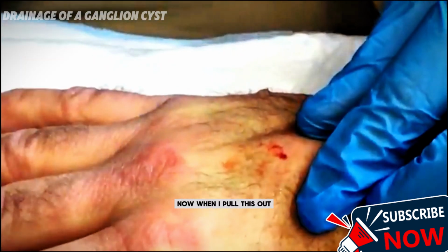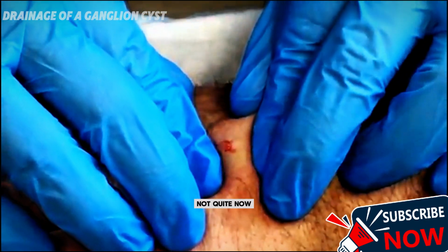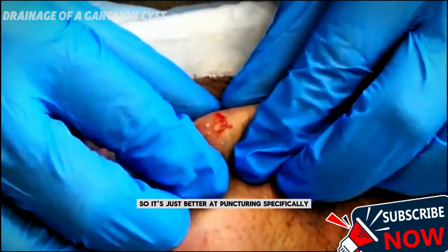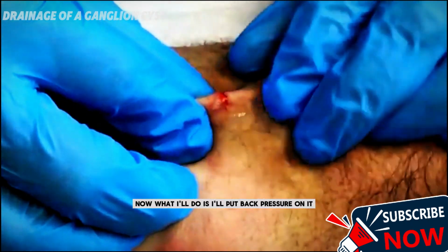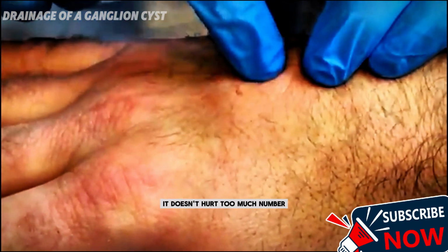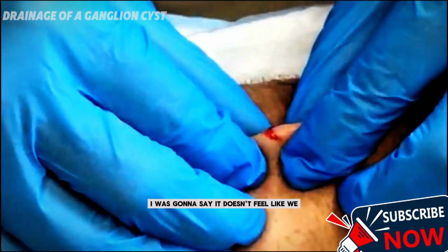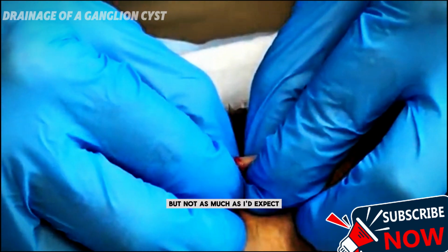Now when I pull this out, you might see a little bit of material coming out. Not quite now. I like to use the number 11 blade, as it's just better at puncturing specifically. Now what I'll do is put back pressure on it. There's no pressure there, it doesn't hurt too much? You'll oftentimes feel it give. Sorry, I was going to say you can see there's some of it there, but not as much as I'd expect.